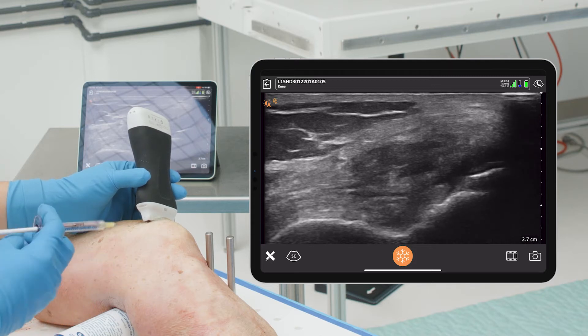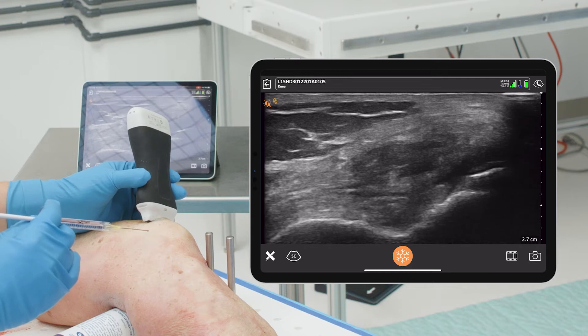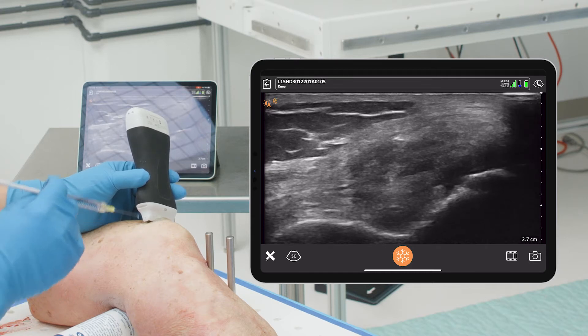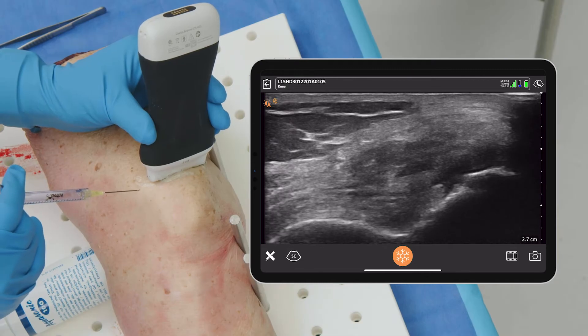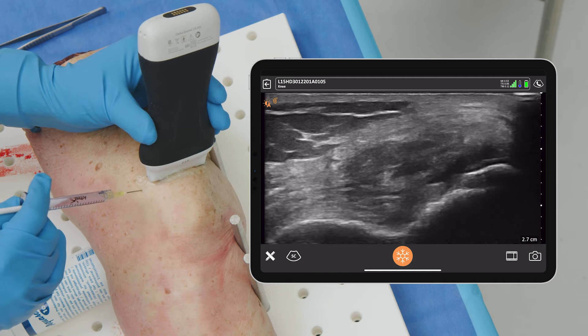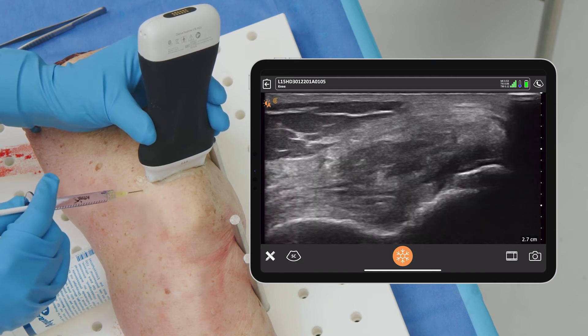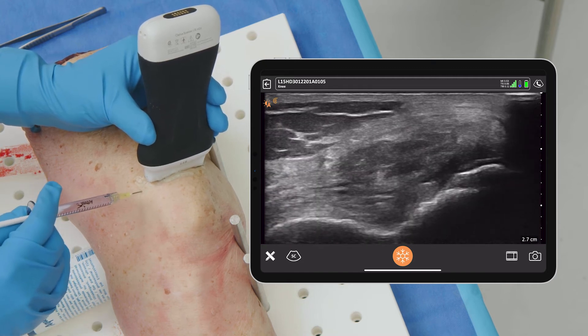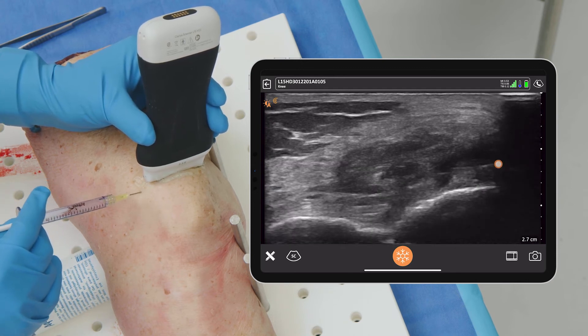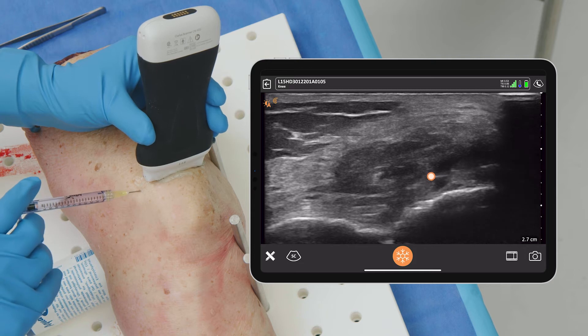We can measure that our entry point is about one centimeter roughly, and that we need to have a slight downward trajectory to get down to that area. But we don't want to hit the bone, we don't want to hit the cartilage, and we don't want to hit the tendon. So if we come in at about a spot right here and just enter in — there's our needle, right into that joint space immediately.